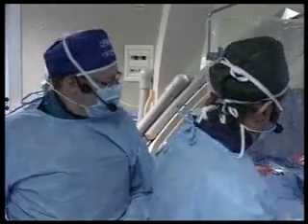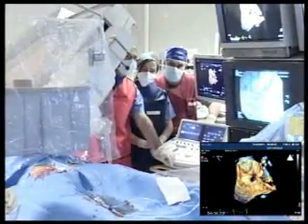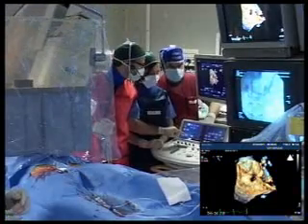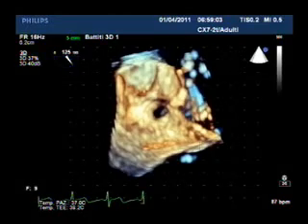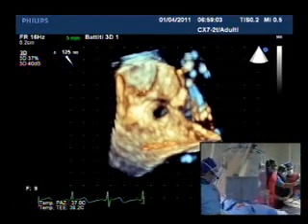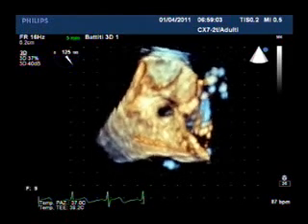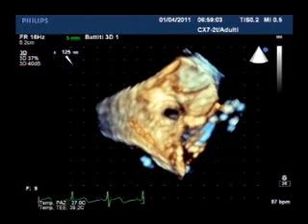Is that right, Carmelo? If I can make a brief comment too, it's actually not possible at the moment with the currently available software to make measurements directly onto the 3D pictures. The only thing I can do is to superimpose a grid on the 3D picture. Every small square, the distance between two dots, is 5 millimeters. So by moving the picture this way, I can have an idea of the dimension, but it's obviously not an exact measurement. That's a very nice technique, I think.